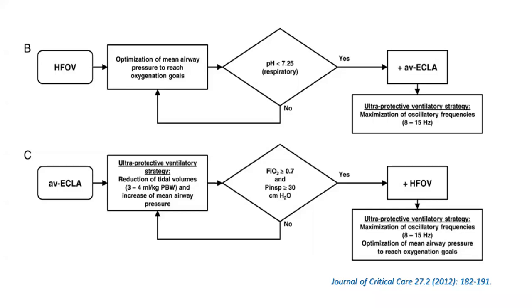We use it rarely in cardiac patients because the main cause in our cardiac patients is not lung disease. And we use it for rescue when we have a bad lung disease, like a reperfusion injury, or some lung condition associated with cardiac disease.